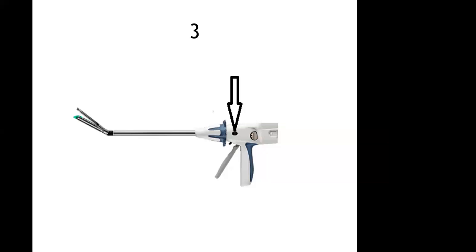Every time you push the trigger, first you finger tighten the instrument by adjusting the knob at the end, and then when you pull the trigger first, it comes to 0, which means the cartridges are opposed.